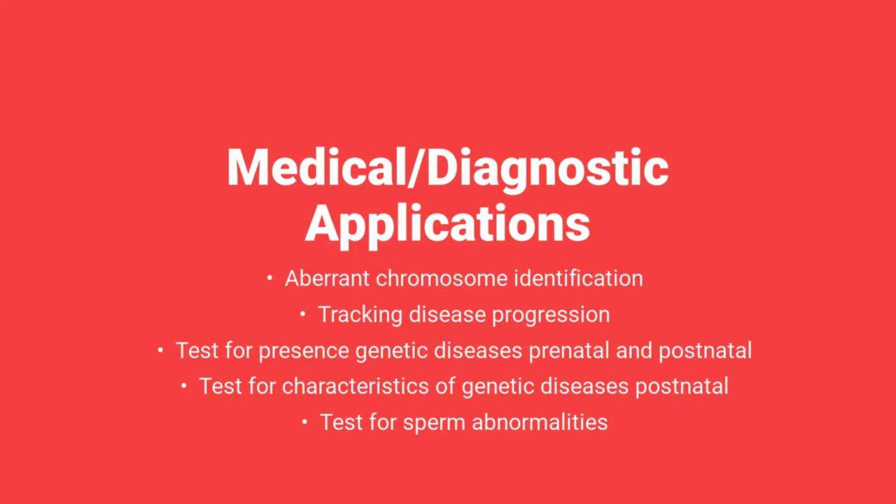FISH can also be used in cancer diagnosis and analysis to generate a quick result. This is because other cytogenetic procedures require cell division to measure results, requiring a cell culture to be grown, which takes time. FISH tests can be used to exploratorily test the location, amount, and extent of tumours in the body, from tissue samples taken in a relatively short amount of time.